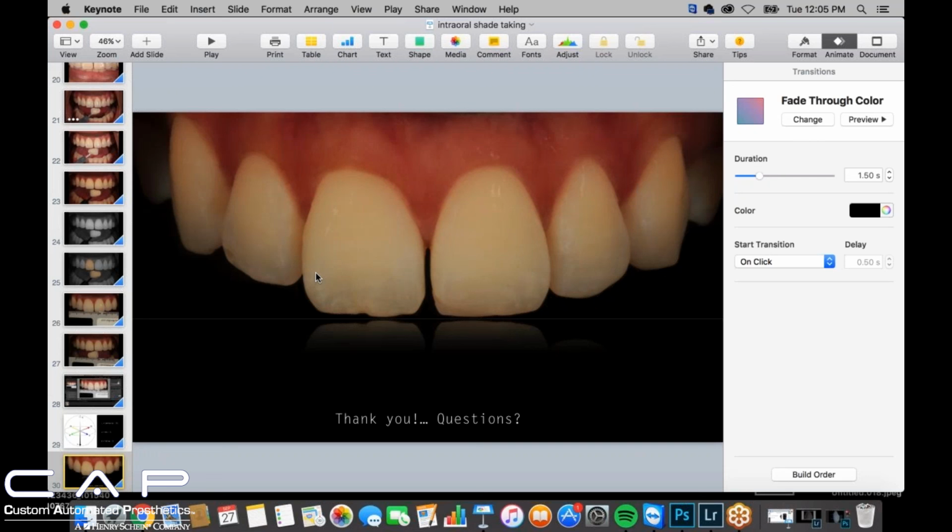It's very thick. But when you add this to your ceramic, it shows you an almost exact replica of what that ceramic is going to look like when it's fired. So it's pretty cool. You can actually build up your crown or add on your effects and see what they're going to look like before you even fire it. And so that's one way I like to see what effects I need to use and how I pick those.